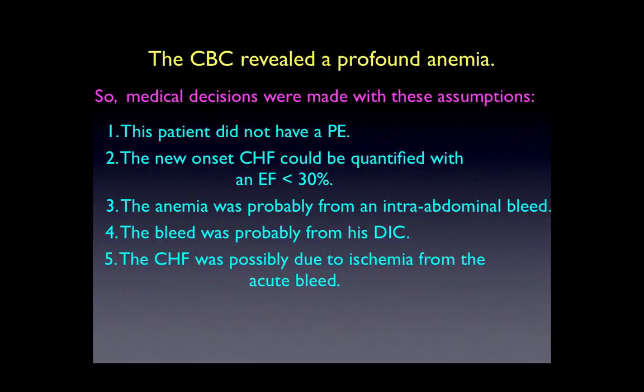Obviously, this would change your clinical management, whether to call surgery for the abdominal bleed, how much fluid to give, whether you wanted to give inotropes. Many decisions could be made based upon this ultrasound, based upon both ultrasounds.